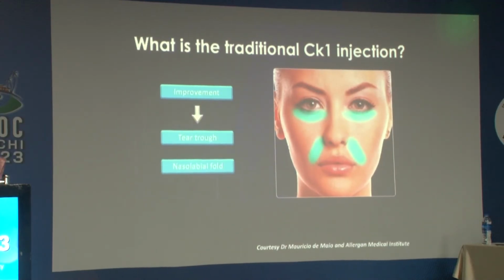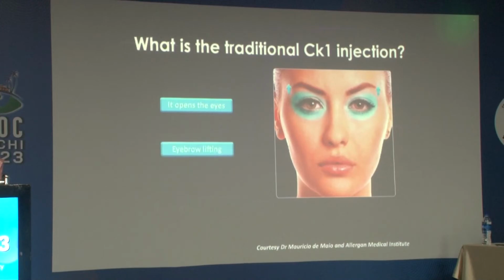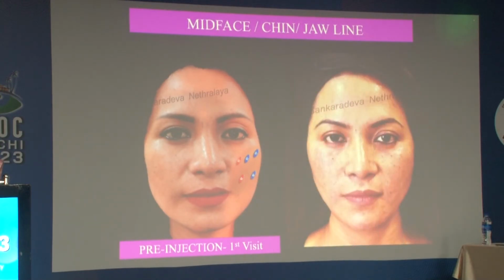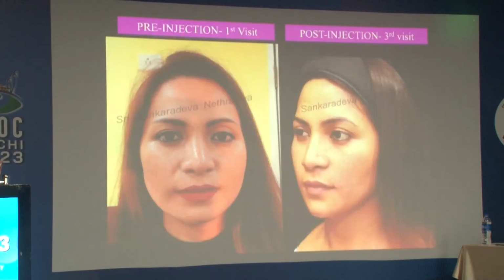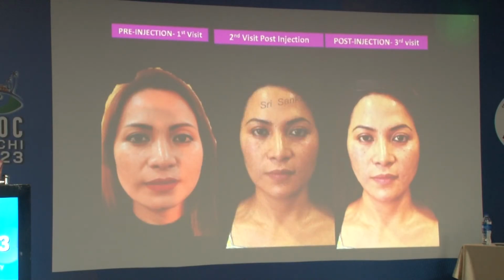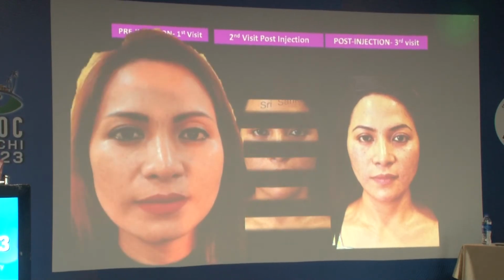You can find that it not only lifts the face, it opens up the eye and also gives some amount of eyebrow lift. So there are different points where you can really ovalize the face, you can slim the face. As you can see, this lady looks much better after the 3rd injection, before and after the procedure. So there are different indications.